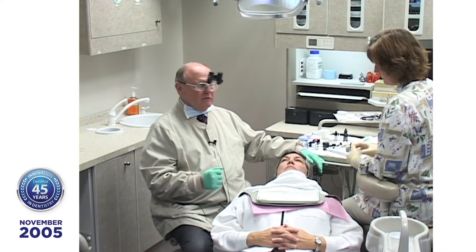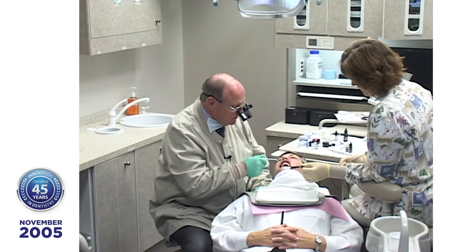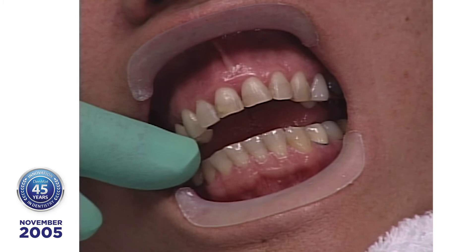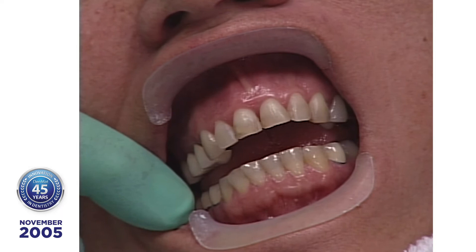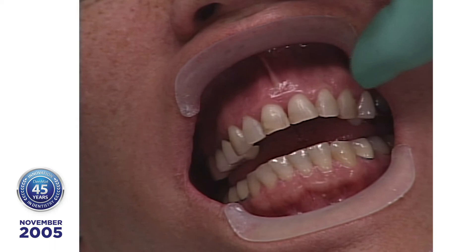Lisa has polished Beverly's teeth with the porcelain polishing paste. We like to use that instead of pumice because it gets rid of the biofilm on the teeth and you get a better etch. We're not going to do anything on Beverly's bicuspids today because one may have to be replaced — there might be some caries on it. Most of the cases we see have little or no recession after 5, 10, 15 years — not any more than you would expect if the tooth had nothing placed on it.